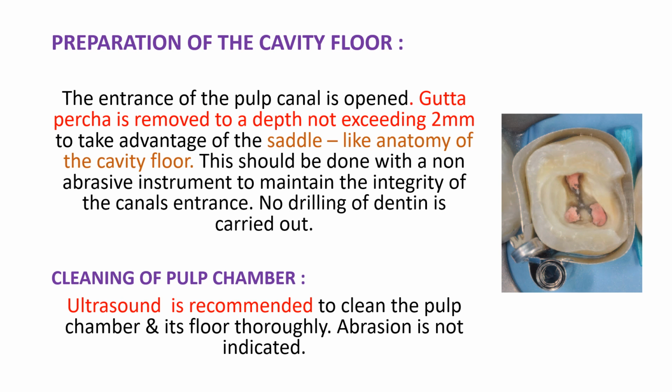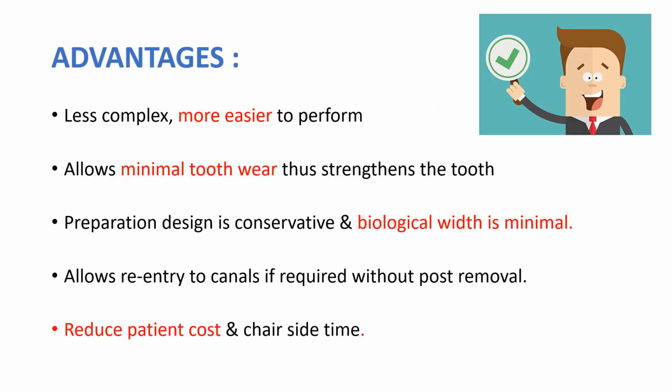Cleaning of pulp chamber. Ultrasound is recommended to clean the pulp chamber and its floor thoroughly. Abrasion is not indicated. Advantages: less complex, more easier to perform.